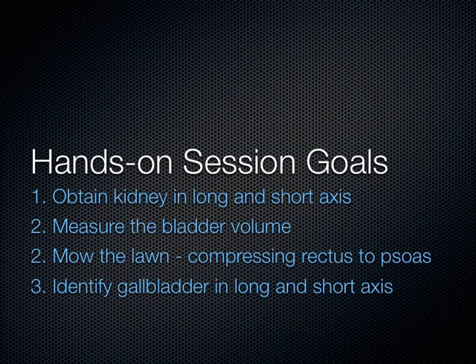Finally, this is the last slide. Just today during the hands-on session, what we're going to do is we're going to get the kidney in the long and short axis, okay? I don't necessarily need you to measure the bladder volume because that takes a little bit to stop and drop calipers and stuff. You can drop a caliper or two if you want, but I want you to demonstrate how you would do it at least to the instructors.